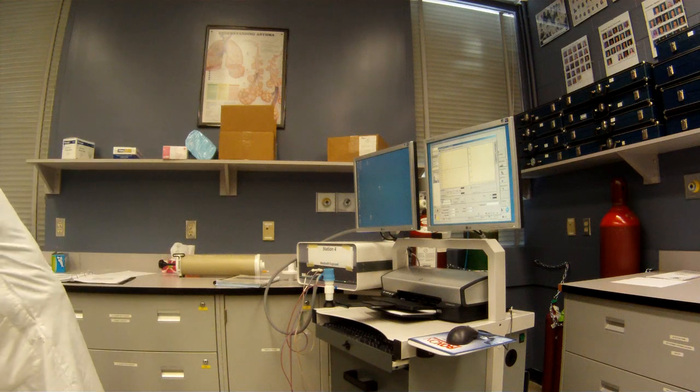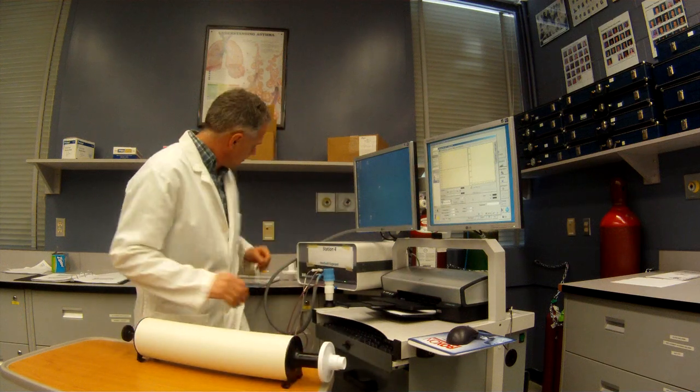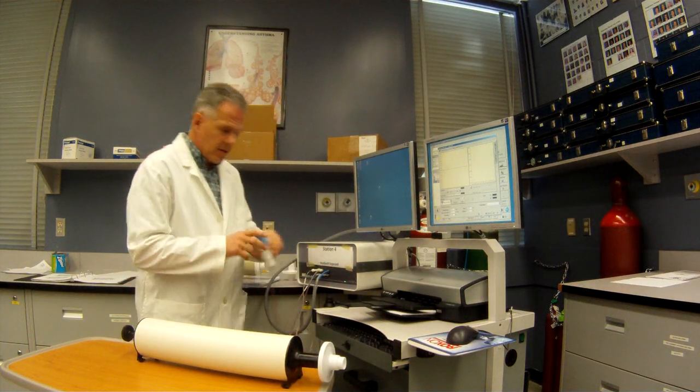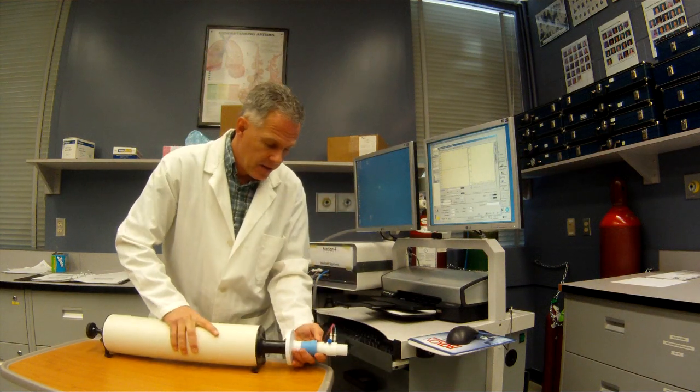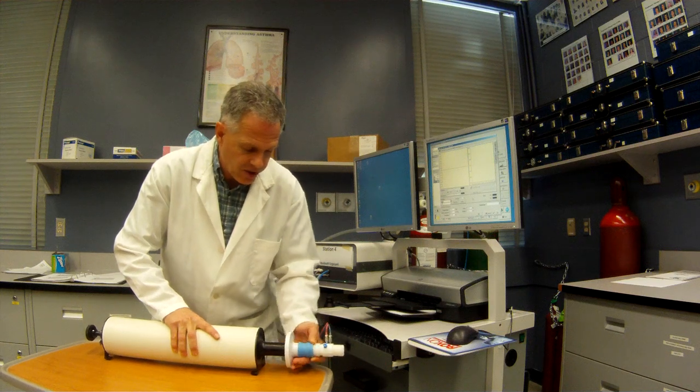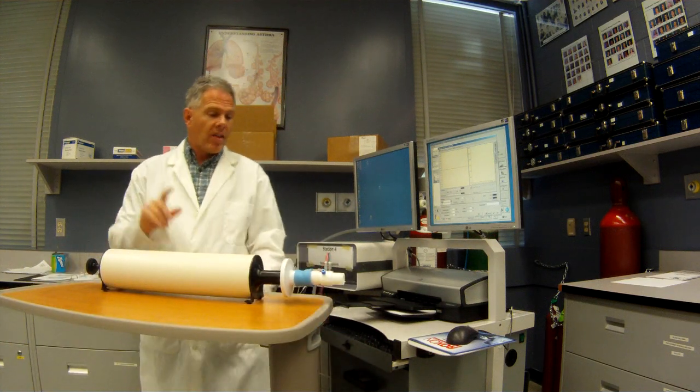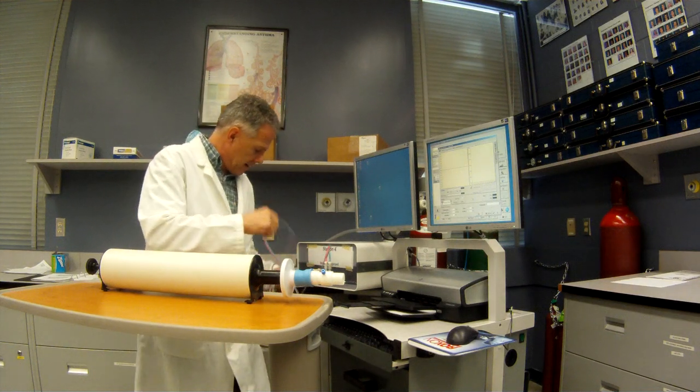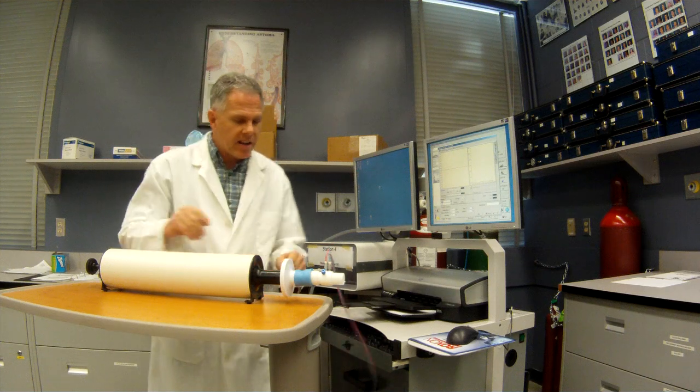So I've got our calibration syringe set up right here. And I'm going to be watching this screen, hook up our pneumotac. So it's hooked up just like it would be with a patient. Except, of course, we've got the calibration syringe on here. Now, this is a very precisely controlled 3-liter syringe. Make sure we don't have any kinks in our tubing or anything like that. No little tears or anything.